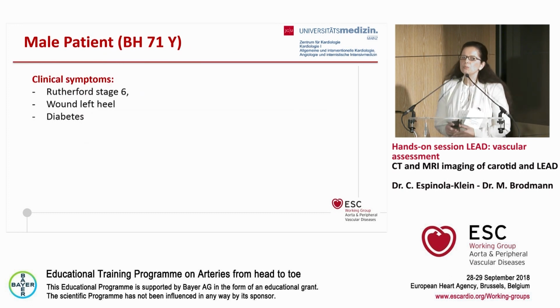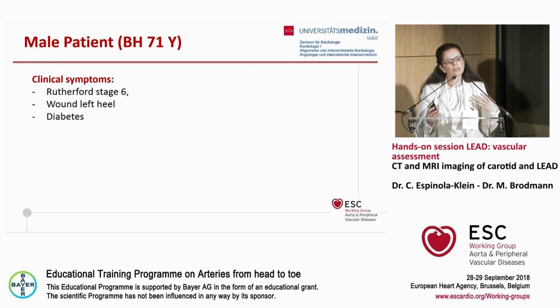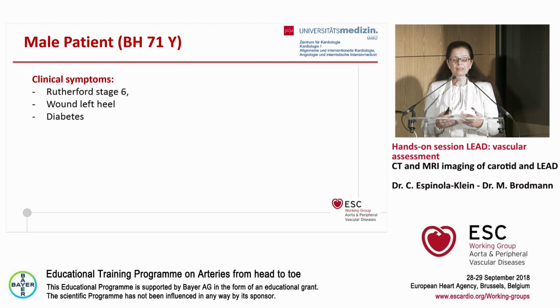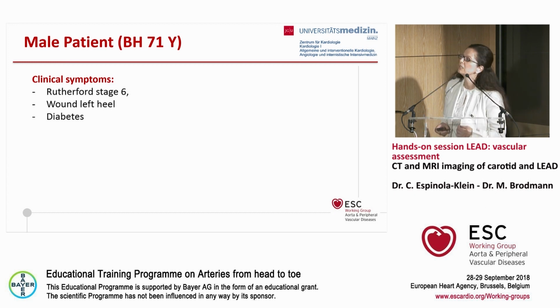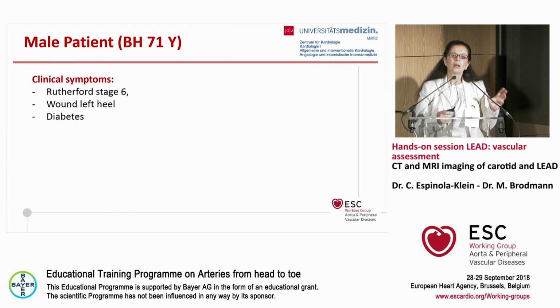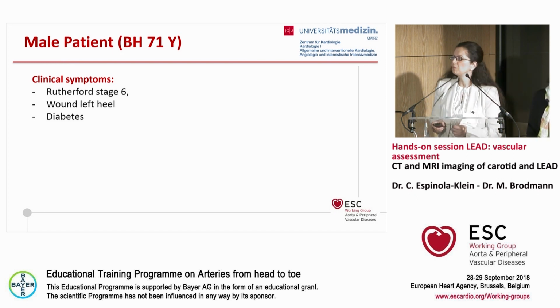Well, most patients, as we discussed already, will profit from MR imaging because we have no radiation and better protection if you have kidney insufficiency in these patients. So we bring with you and discuss on the different cases MRI images, and in which cases we should maybe add a CT scan to add additional information.